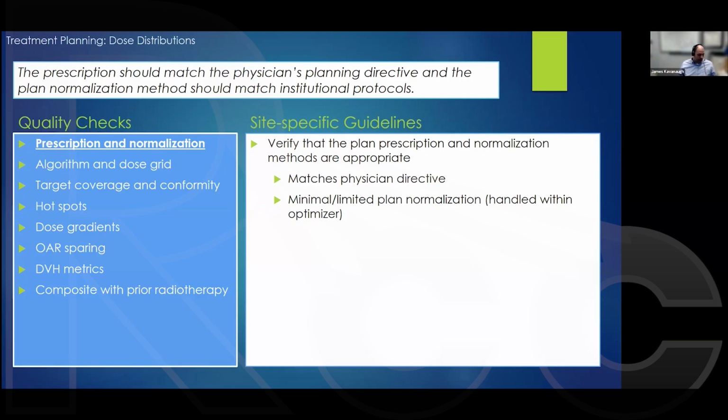So as I was trained, ideally you are controlling, especially when you get into the SIB world, where every plan may have multiple different dose levels and multiple different OARs. A gross normalization of just increasing the whole plan MU up or down by more than 1% was heavily frowned upon. We wanted to control the dose in terms of how much it was pushing each structure within the optimization itself.